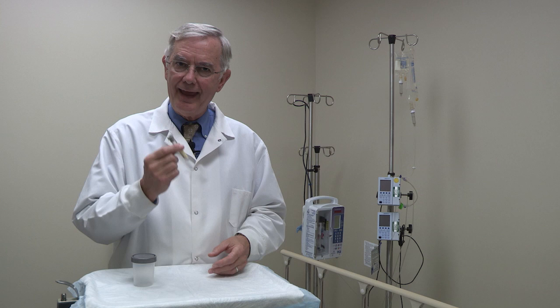Now the collector should label the container properly. If the specimen is not taken to the lab within 30 minutes, put the container in the refrigerator until it can be taken to the microbiology lab, unless you're using the boric acid container, and that need not be refrigerated.